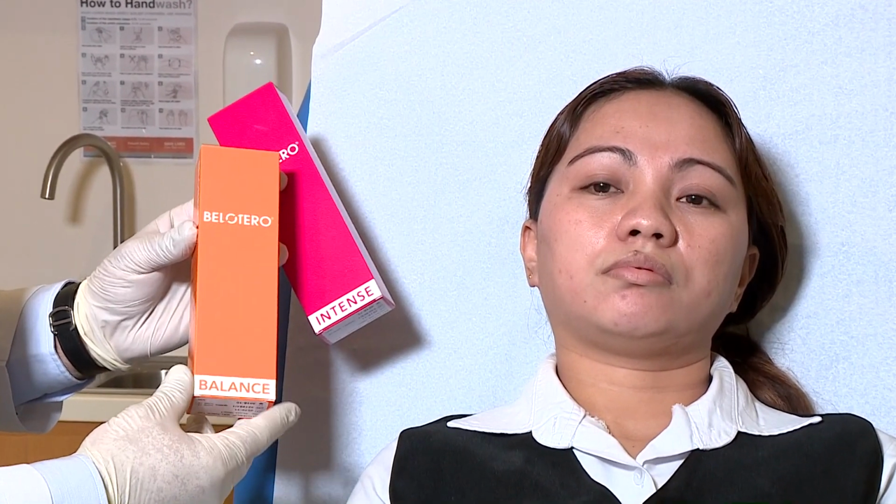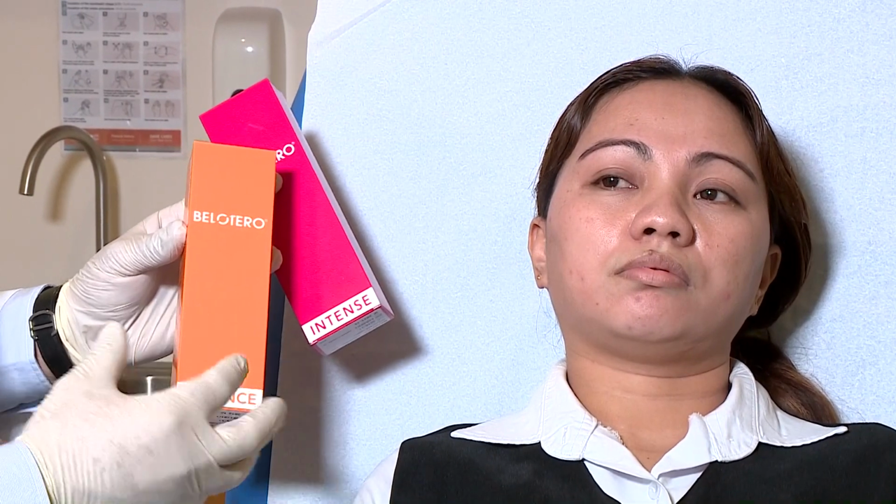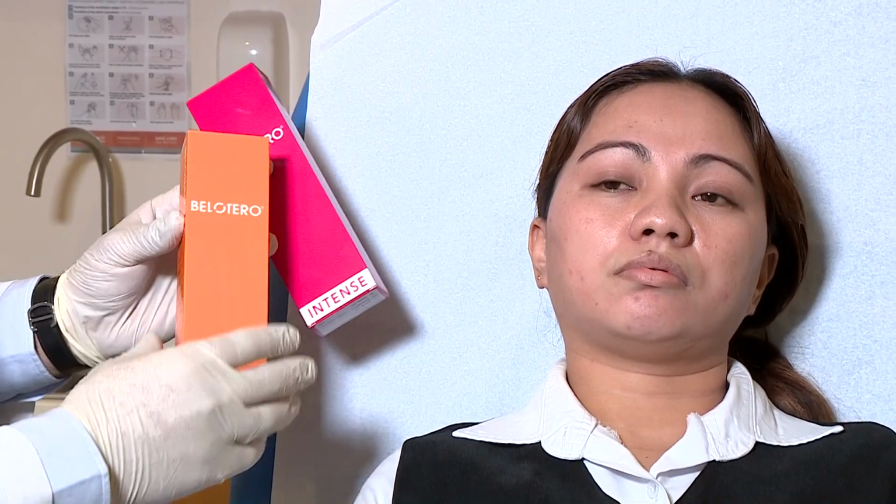Choosing the hyaluronic acid product is the most important thing. The most common products used for the lips are either Belotero Balance or Belotero Intense. Belotero Intense is for more volumizing of the lips, because the concentration is 25 milligrams of hyaluronic acid per cc, and it comes as a 1 ml syringe. Belotero Balance is 22.5 milligrams per cc, and it is usually for less volumizing and more rejuvenation.